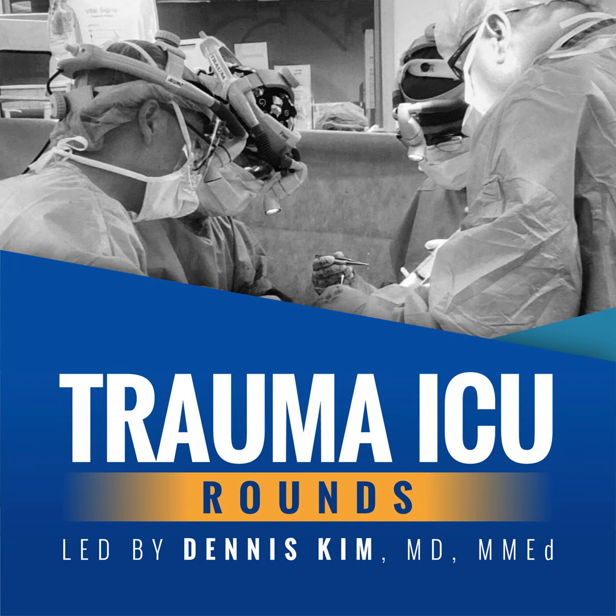In VCMV, or volume continuous mandatory ventilation, if we set a rate of 12 and tidal volume of 500 cc's, then that patient will receive a breath every 5 seconds with a tidal volume of 500 cc's for a minute ventilation of 6 liters per minute. Now, breaths can be machine or patient triggered, and given that our patient is paralyzed, every breath will be time triggered by the machine based on the set rate, and this is what we mean by controlled ventilation. In the control mode, the patient makes no spontaneous effort.